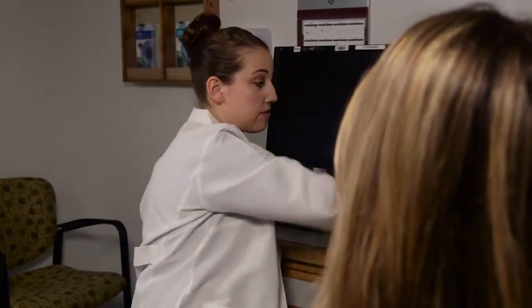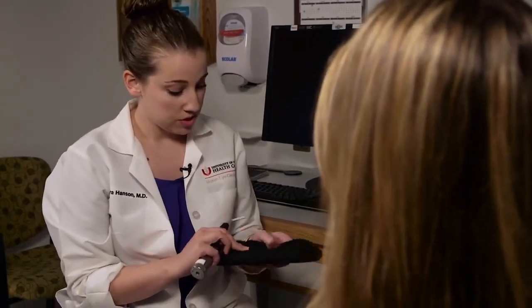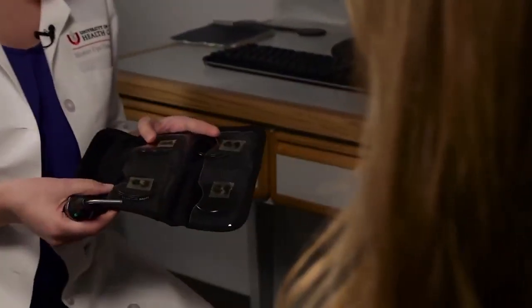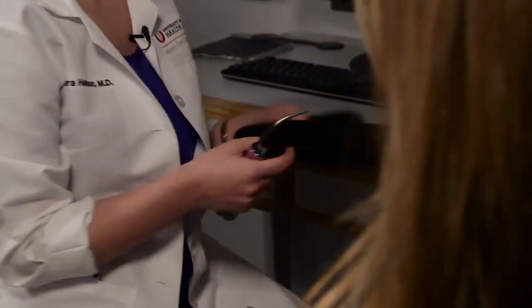Okay, so now we're going to be testing for an afferent pupillary defect, and we'll talk about how to measure the size of the defect. All you need is a muscle light and some neutral density filters. The ones that we have here are in 0.3 log unit increments, and we have a 0.3, 0.6, and 0.9. So you're going to start out by asking the patient to focus on something in the distance. You're going to use the muscle light to shine into each eye.